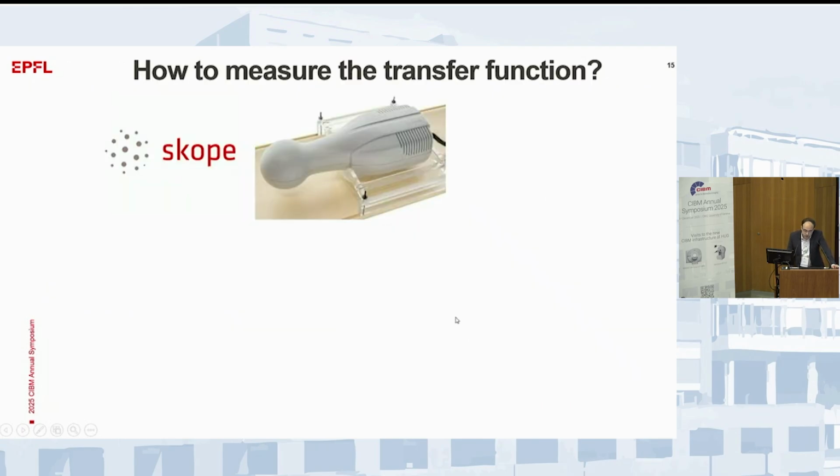The way to measure this type of system function, the most formal way, that also takes into account all the imperfections of the system, would be to use a field camera approach, and this is a separate piece of instrumentation that you can put inside your scanner and measure very reliably, as a separate type of measurement or a separate experiment.